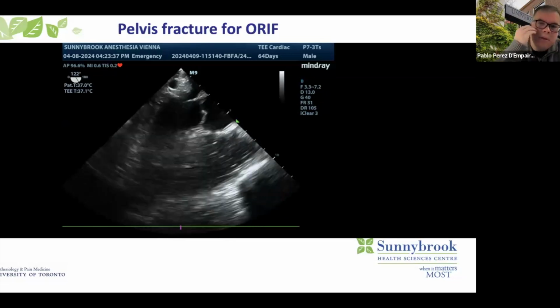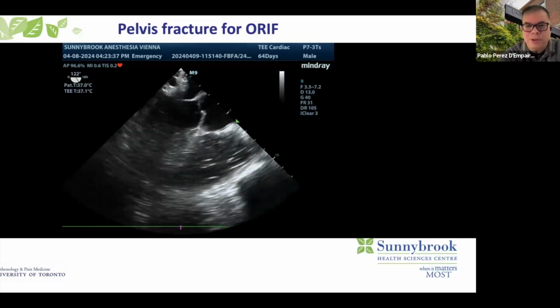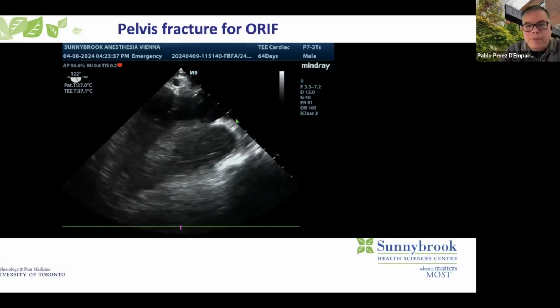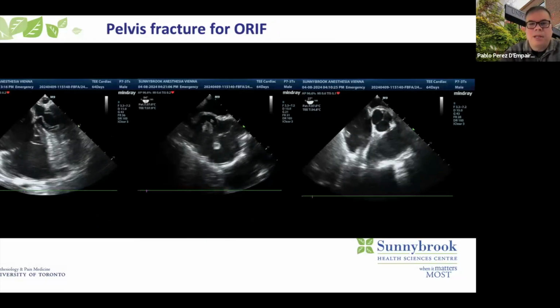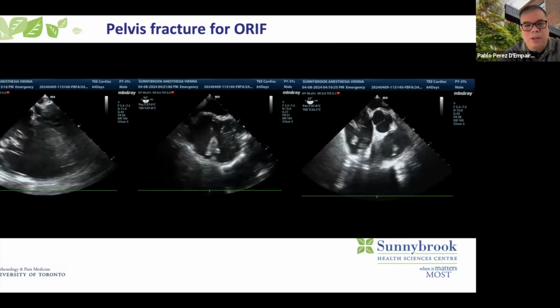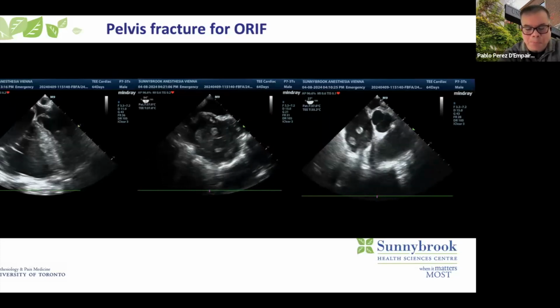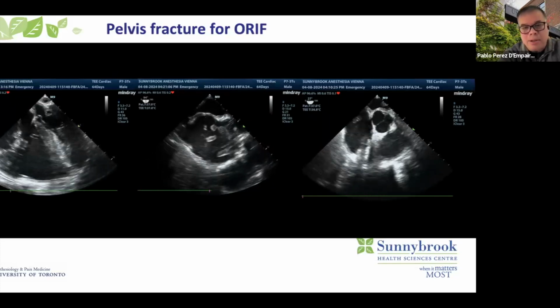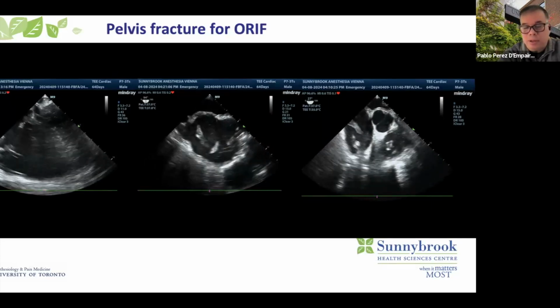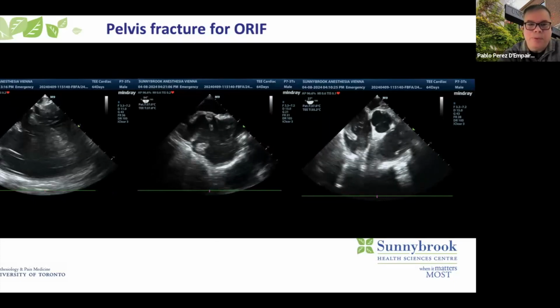And this is just during the CPR, just to illustrate another very important point that we'll go over in detail a bit later. After putting the probe in, we can now clearly demonstrate that there's a massive amount of what looks to be clot in transit in the RV and into the PA. And having this diagnosis changed the management completely, because this patient was quite lucky that it happened in the middle of the day with a lot of people around.